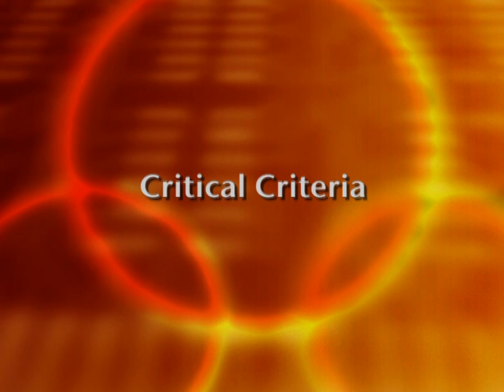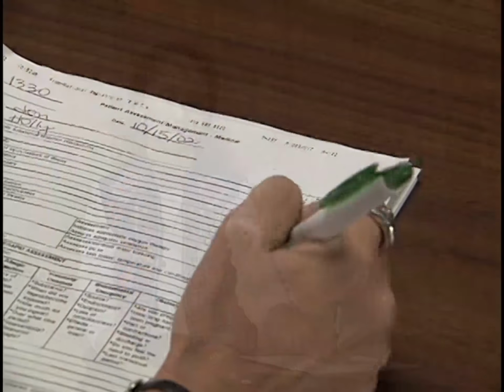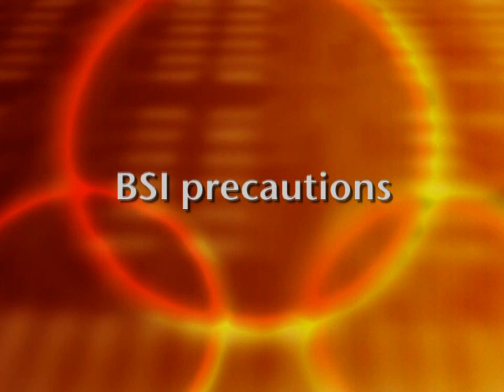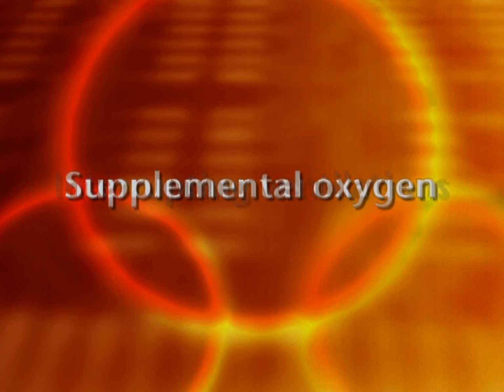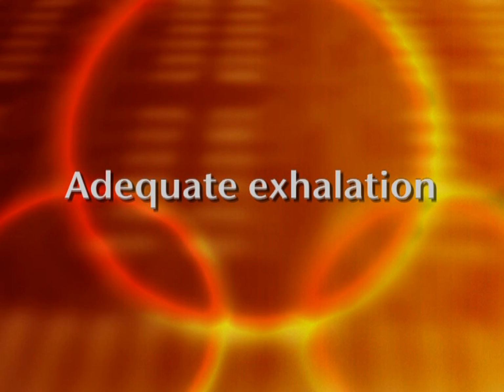With the scenario complete, the examiner checks the candidate's performance against the critical criteria for the station. The items at this station that would result in failure include failing to take or verbalize the use of body substance isolation precautions, failing to immediately ventilate the apneic patient, interrupting ventilations for more than 20 seconds, failing to provide a high concentration of supplemental oxygen, failing to provide or direct the second rescuer to provide proper volume, and failing to allow for adequate exhalation.